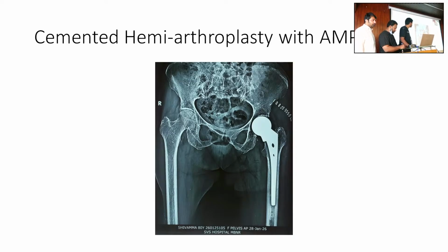Is the mechanics of the joint restored now? Offset, vertical and horizontal offset? Restored? You have seen on the table. Yes, sir, we had seen the limb. No limb length discrepancy. No, sir. We had checked for rotation, sir.